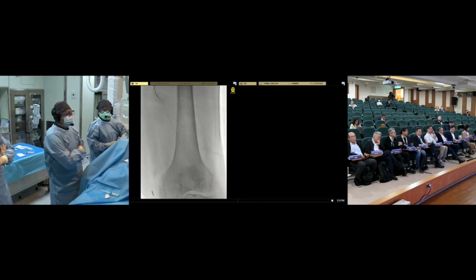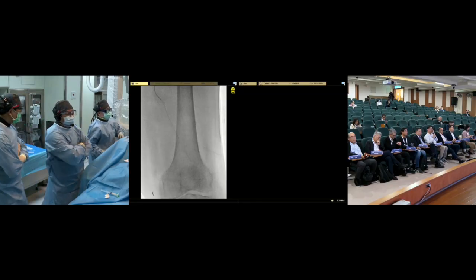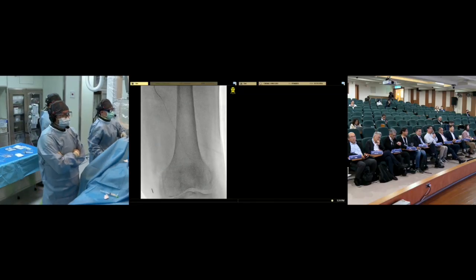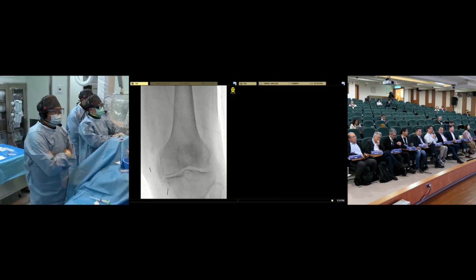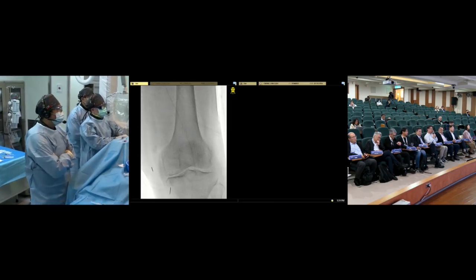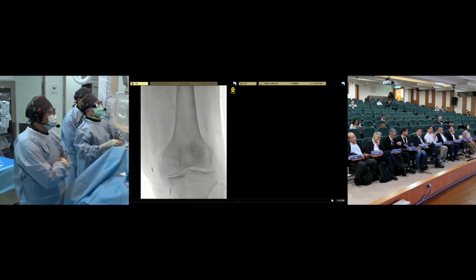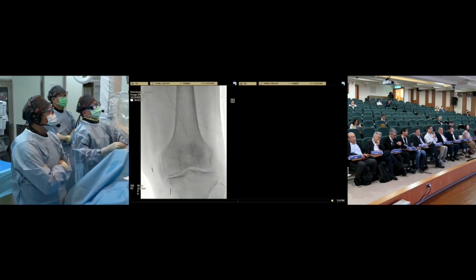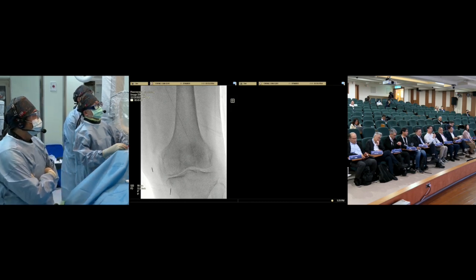Does the embolization strategy have any difference between these agents? For example, I see you don't usually do super selective embolization in this patient. You mentioned that if you use the temporary agent, you will be more selective. What's the difference?